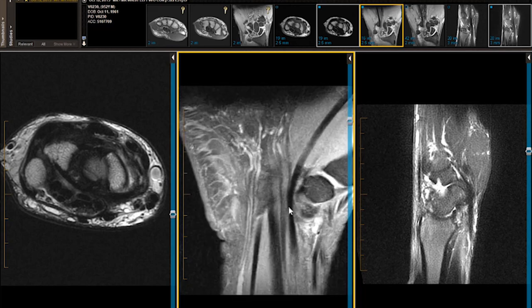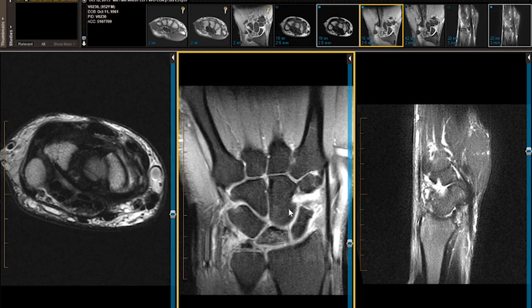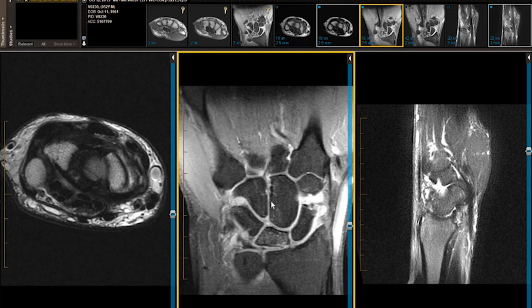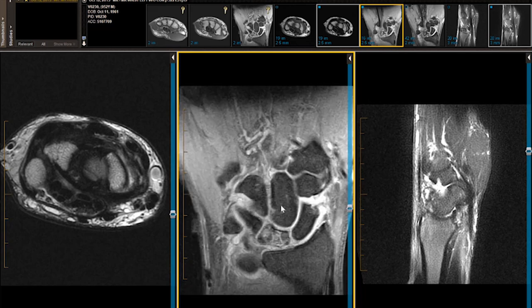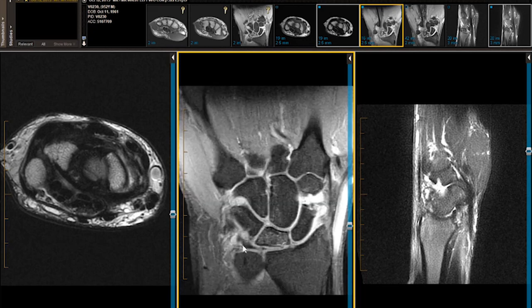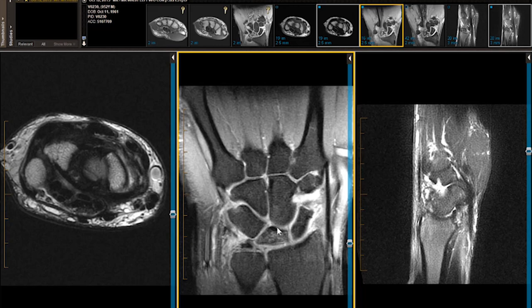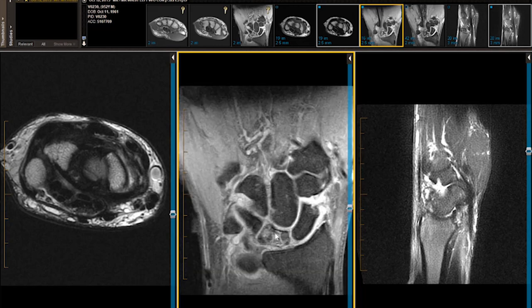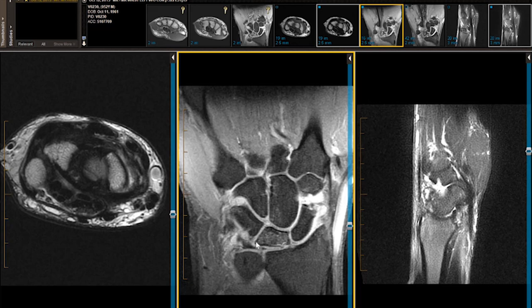I always like to start my search pattern in the coronal projection. I look at the relationship of the carpal bones and see how inflamed the joint is — it's pretty inflamed. I look at the shape of the radial styloid and ulnar styloid, which look normal. I look at the overall volume of the carpal bones, which are all normal with one exception: the lunate is abnormal. It's slightly decreased in overall height and it's undulated.